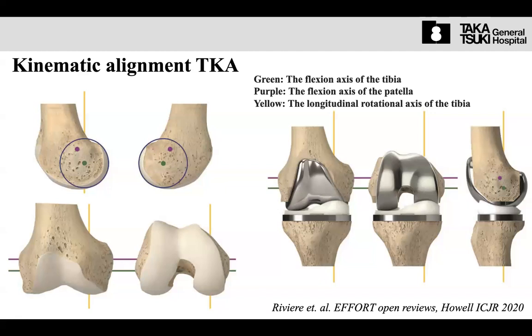So to stabilize the kinematics, through the flexion extension around this condylar axis and the rotation of the tibia around this medial vertical line, the so-called medial pivot motion, this kind of component induces such a perfect motion.